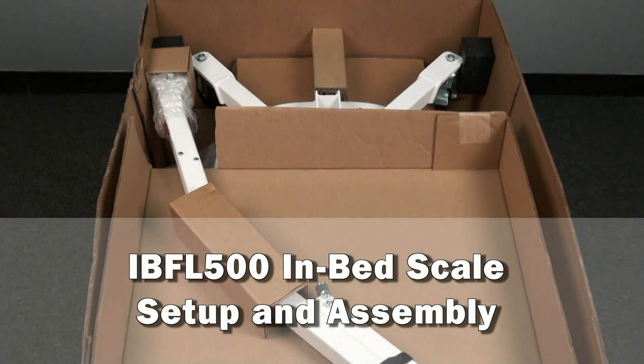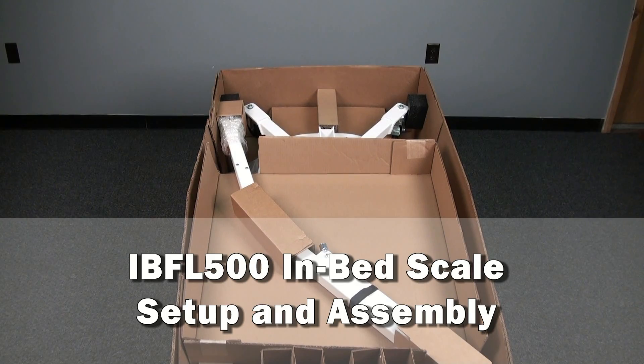This video will walk you through the setup and assembly of a USA-made Detecto IBFL 500 in-bed scale.